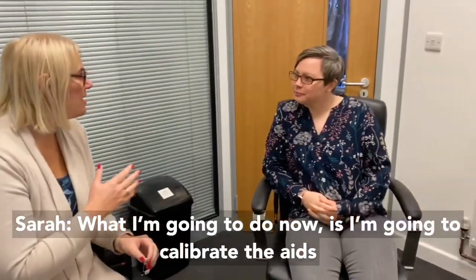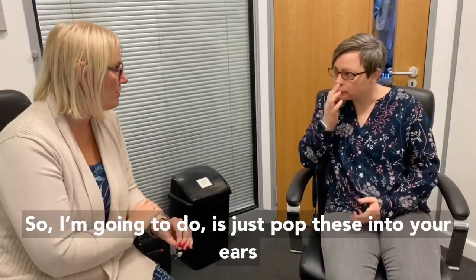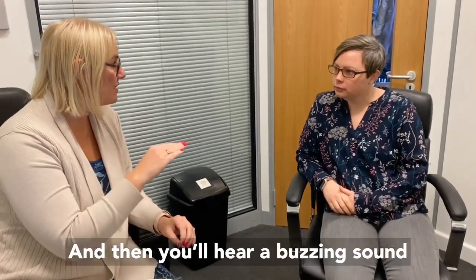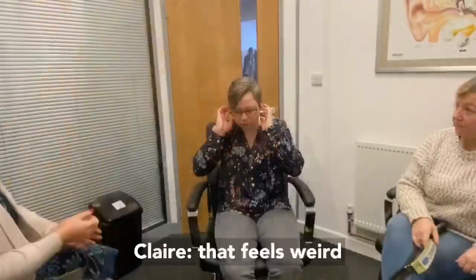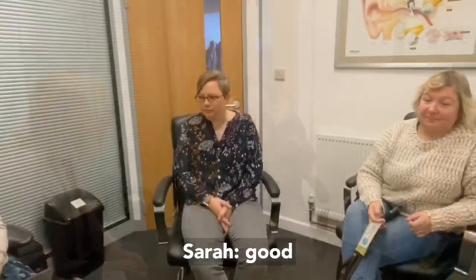Okay, so what I'm going to do now is I'm going to calibrate the aids. So what I need to do is just pop these into your ears. So you won't hear anything to start with, and then you'll hear a buzzing sound. You just need to keep really quiet for me. They'll buzz and then we'll turn them on. All right? So, how do they feel? Quite comfy. Good.